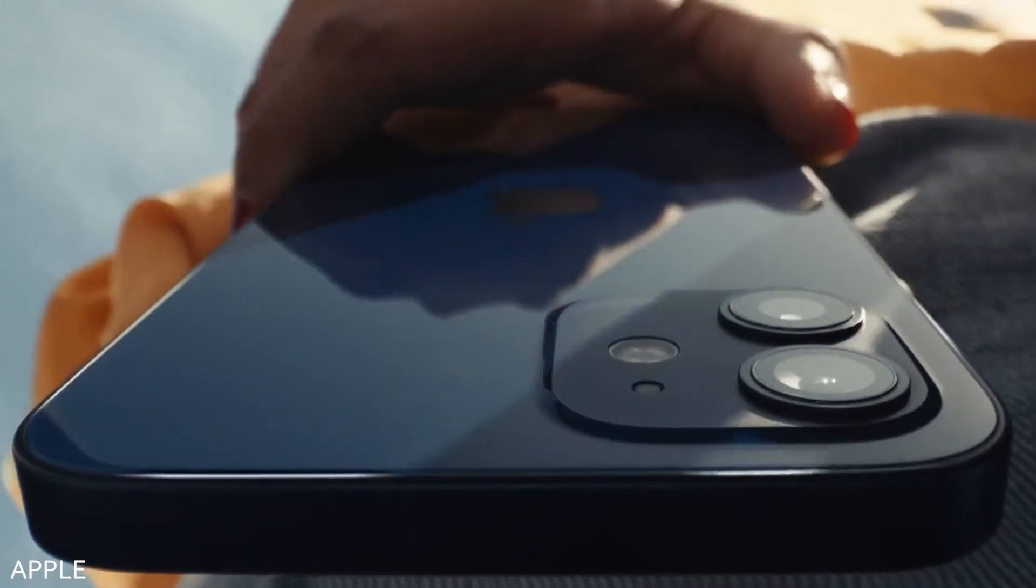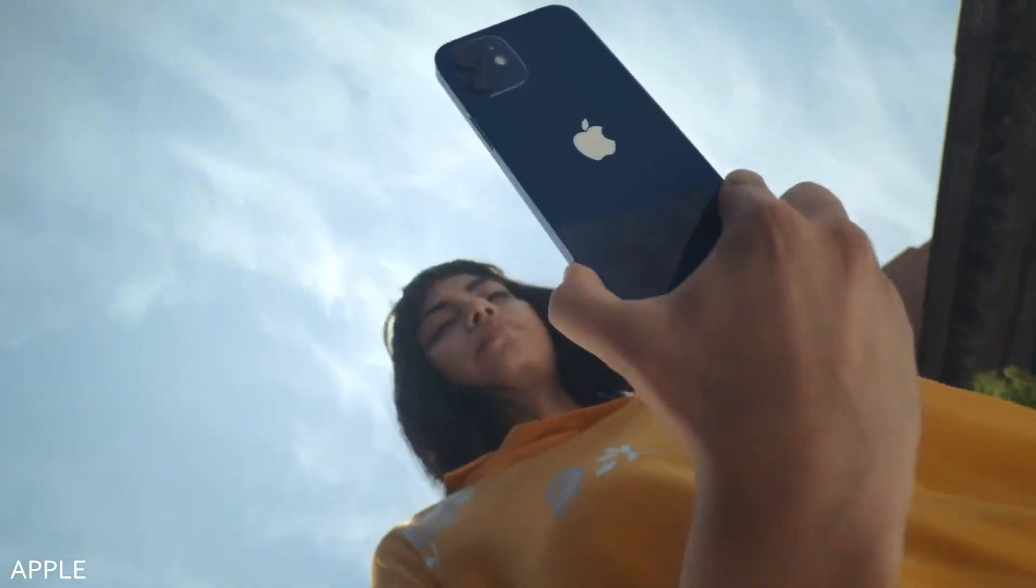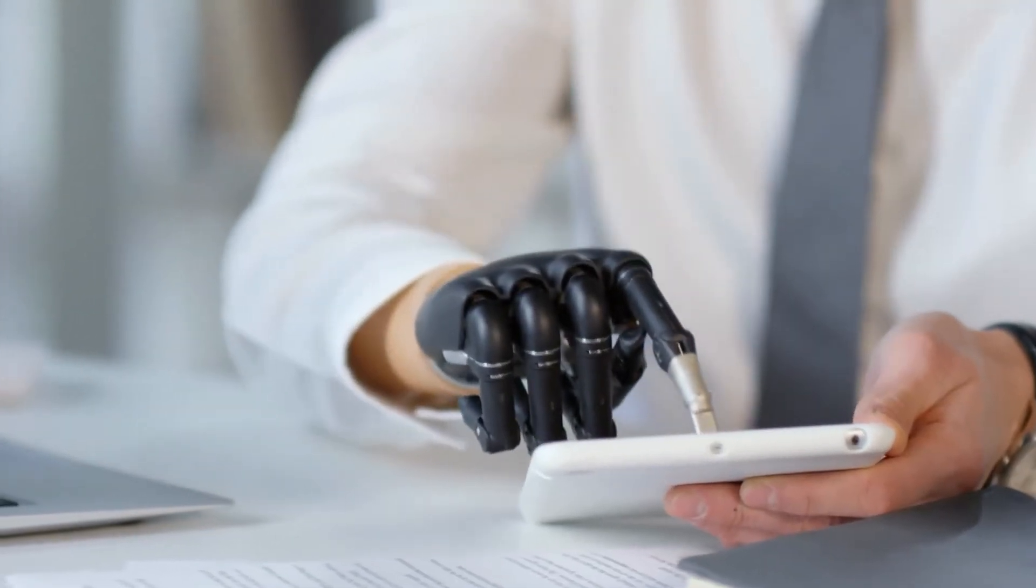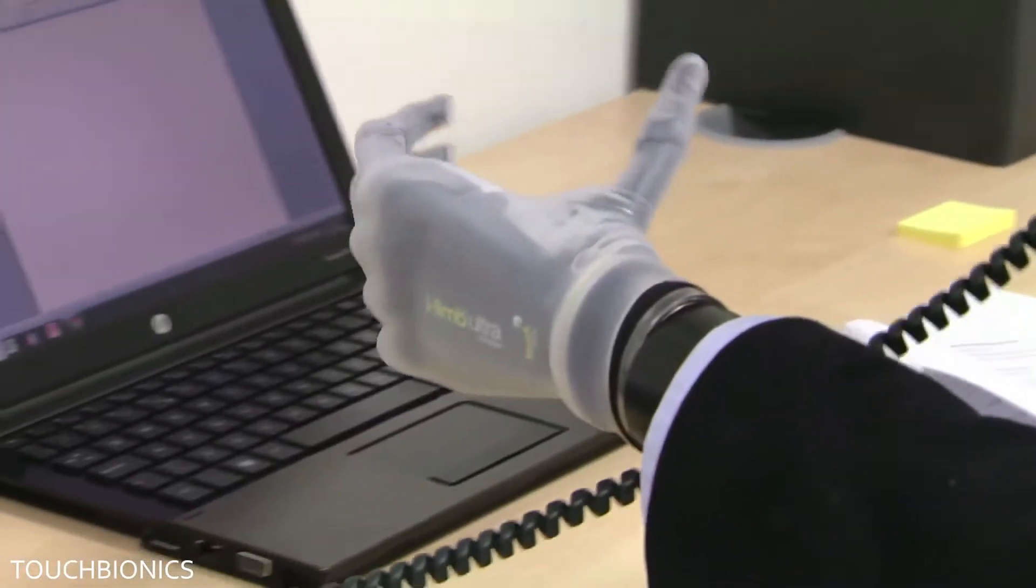Number 10. iLimb. No, it's not another product from Apple. The iLimb is the world's first commercially available bionic hand, released in 2007.